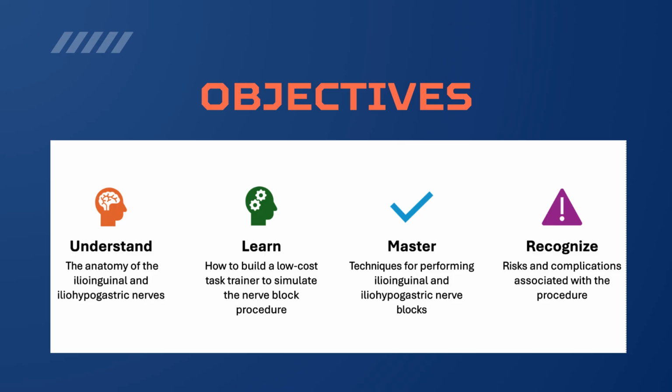By the end of this video, those watching will gain an understanding of who could benefit from these blocks. They will also learn how to identify anatomical landmarks and map nerve pathways, create a simple and effective task trainer, demonstrate how this model will enhance procedural techniques and clinical practice, as well as briefly review nerve block-related complications and best practices.